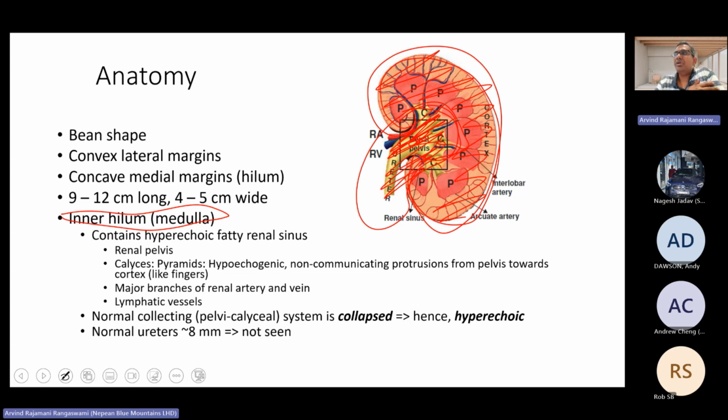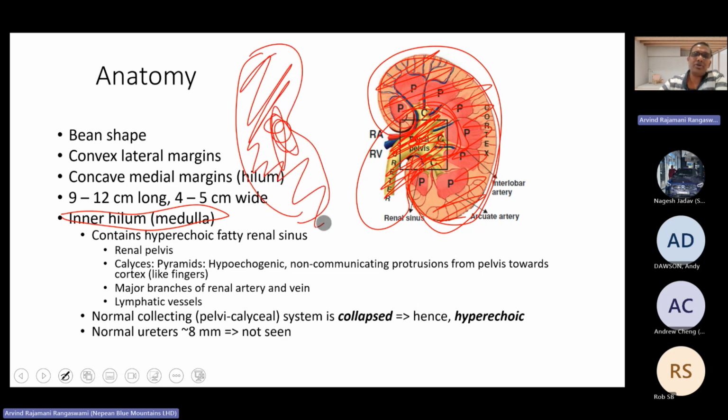Okay, and therefore, as a proportion, it has far more blood supply compared to tissue, and therefore it is extremely hypoechoic. And this contrast is beautiful. You can immediately identify this beautiful contrast where you have a structure which this part is white, this part is almost black or dark gray, and you'll be able to identify it.